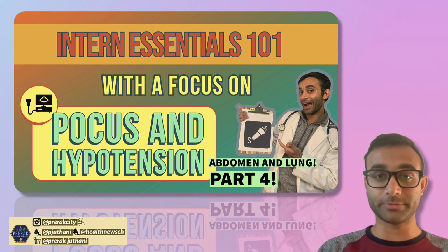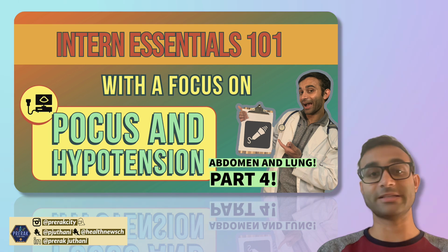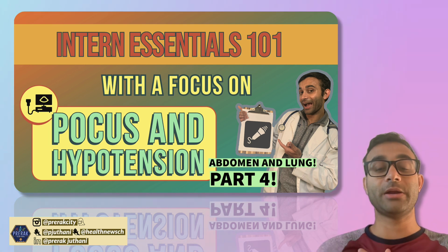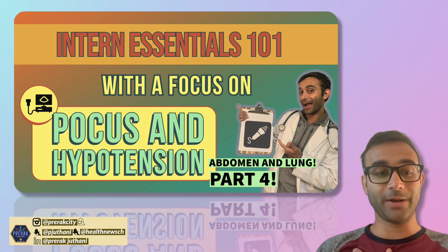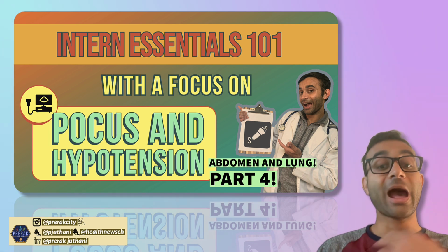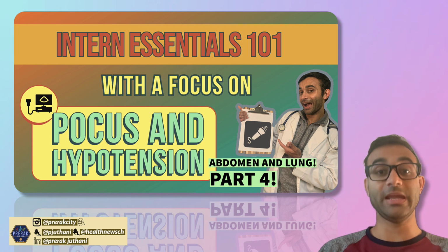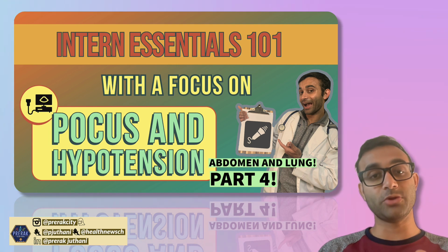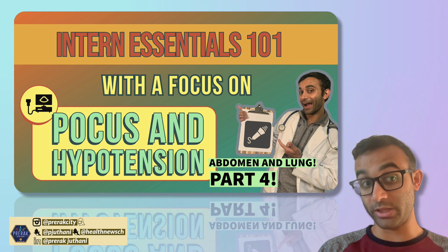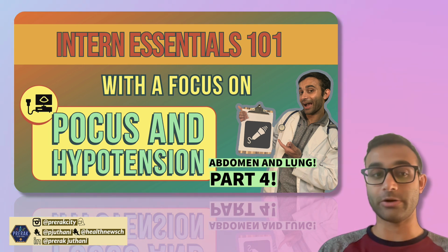Someone's having right upper quadrant pain, I can take a look at their abdomen and assess for cholecystitis, pericholecystic stranding, right? You can also assess for stones and things like that. And so I'm going to talk a bit about how to address hypotension specifically and how to use your abdomen ultrasound as well as a lung ultrasound to help you with your overall assessment of hypotension, which is very important.